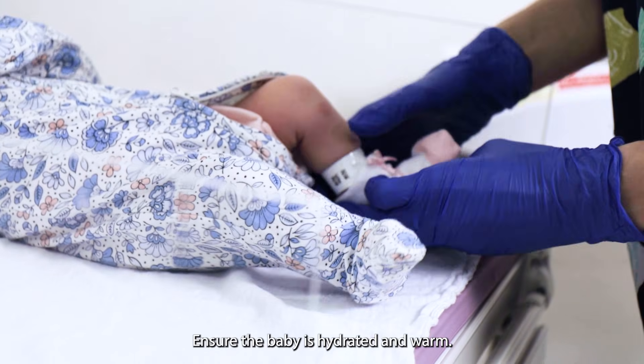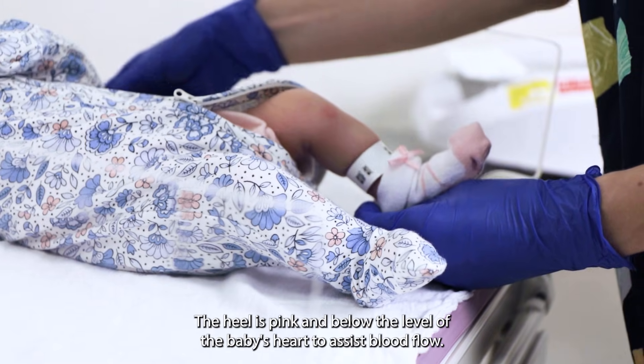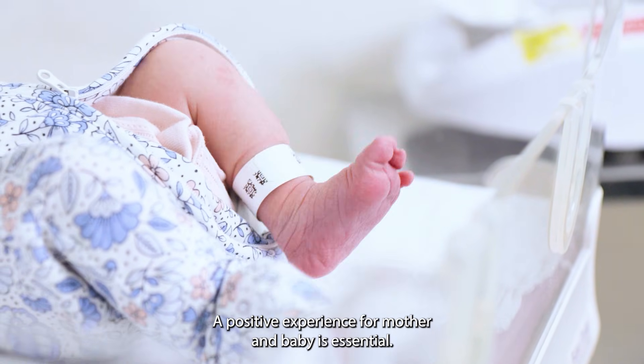Ensure the baby is hydrated and warm, and the heel is pink and below the level of the baby's heart to assist blood flow. Good pain management cannot be overstated. A positive experience for mother and baby is essential.